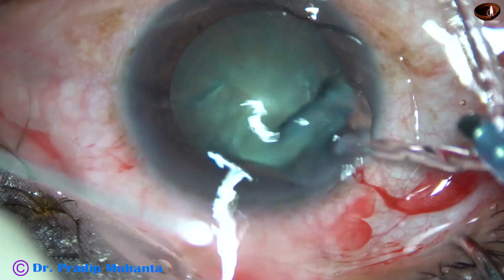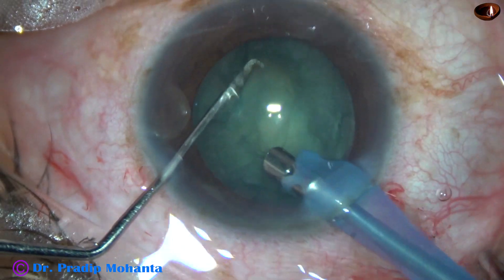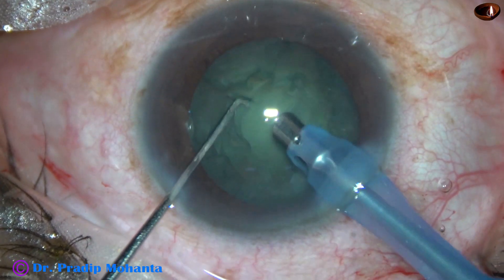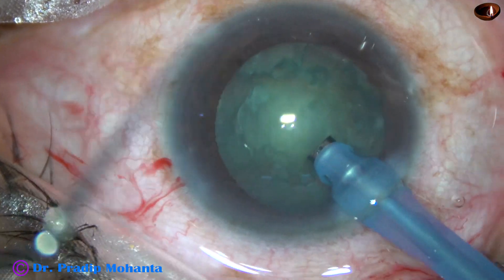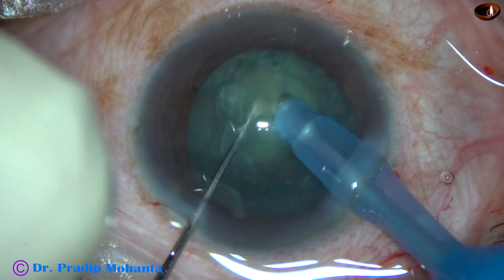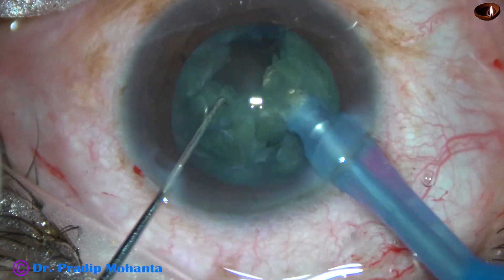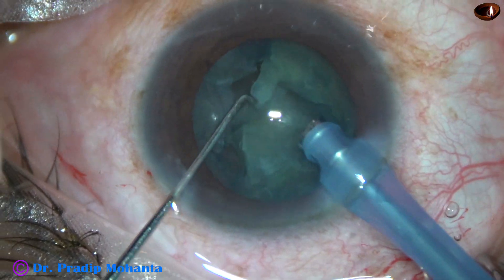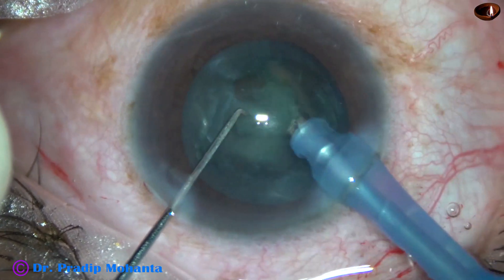The tip of the phaco needle goes in, some superficial cortical lens matter is removed, and then the nucleus is rotated nicely. The handpiece is turned to make the bevel up. The exposed part of the phaco needle is not much — when the cataract is soft, we don't need much exposure. About 2 to 2.5 mm exposure is enough. This nucleus is brittle and soft. I could hold the nucleus gently with low vacuum, and the nucleus is managed.